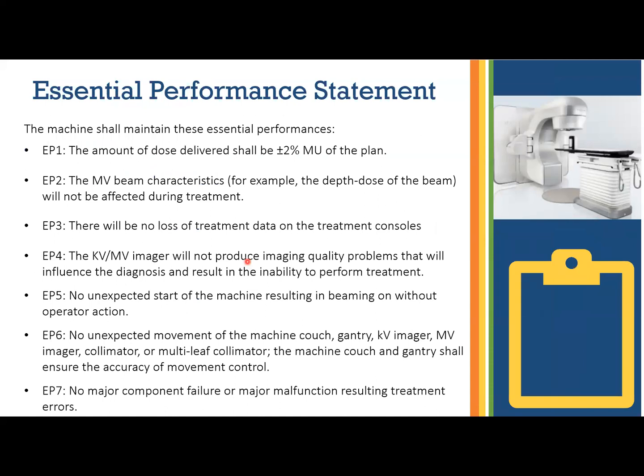Essential performance statement of the machine. Machine shall maintain these essential performances. This is from the vendor side. The amount of dose delivered shall be plus minus 2%. The MV beam characteristics will not affect the treatment. There will be no loss of treatment data on the treatment console.